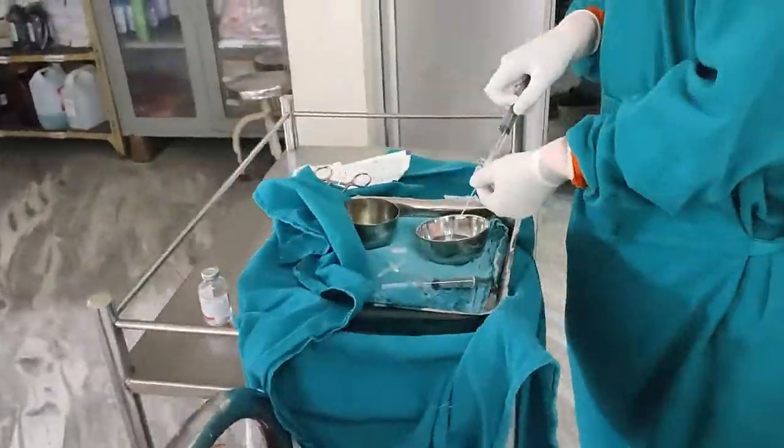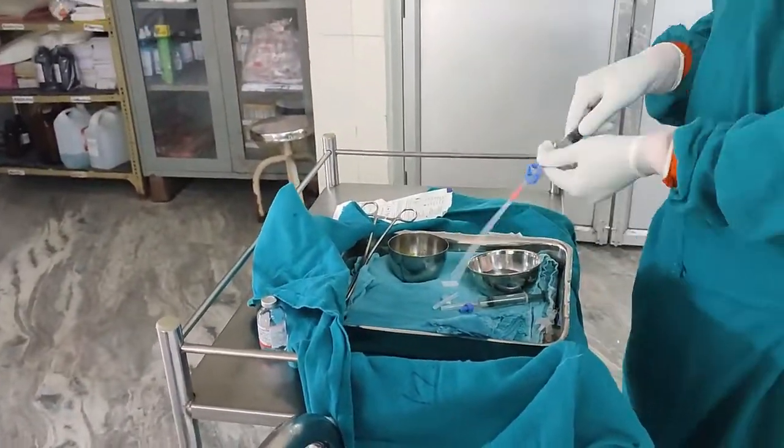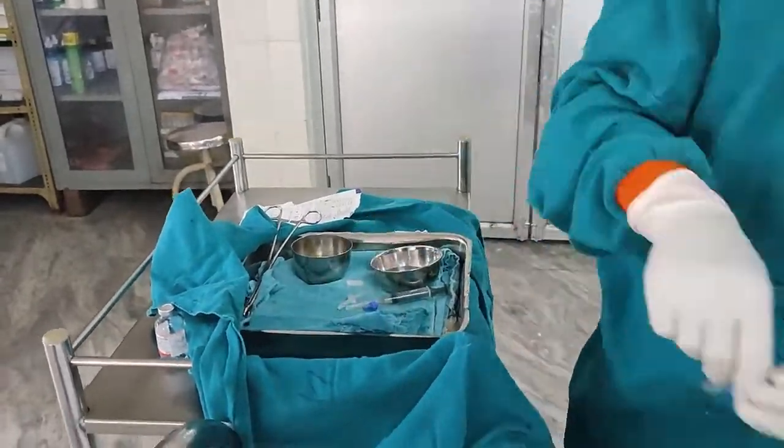Now I am going to flush this cannula and also flush this femoral catheter. We are flushing with a normal saline and heparin mixture so that there won't be any clot during insertion.